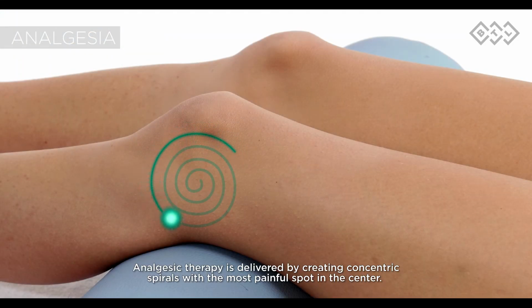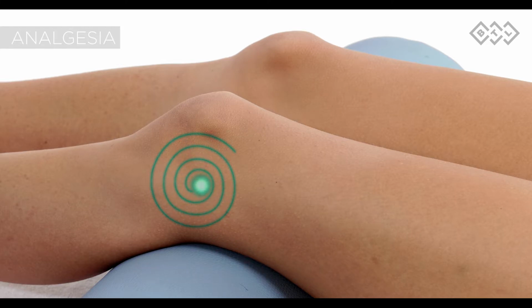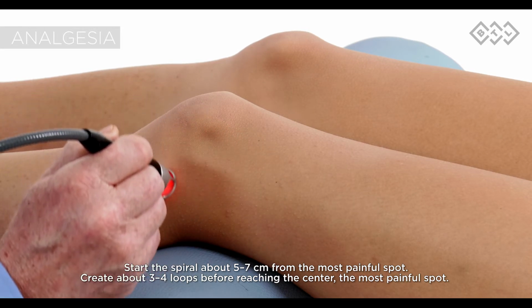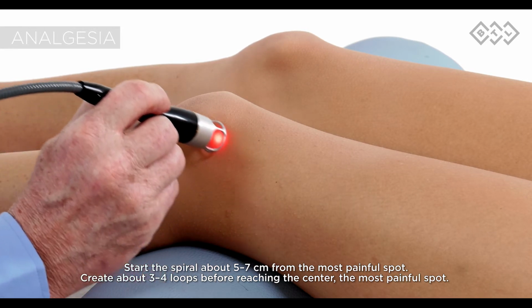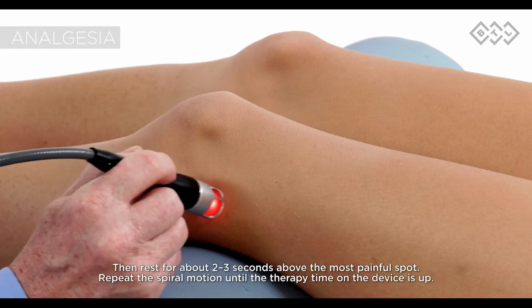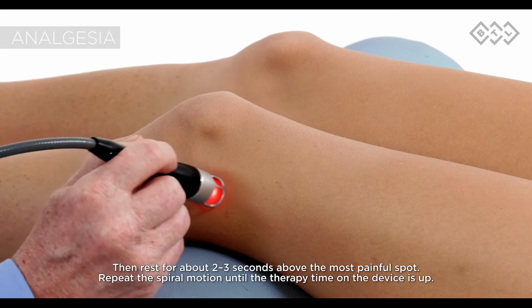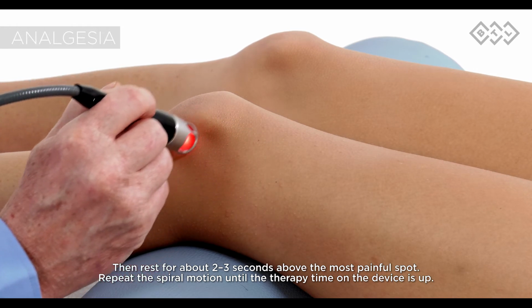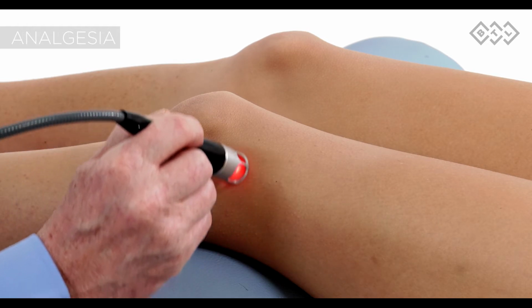Analgesic therapy is delivered by creating concentric spirals, with the most painful spot in the center. Start the spiral about 5 to 7 centimeters from the most painful spot. Create about 3 to 4 loops before reaching the center, the most painful spot. Then rest for about 2 to 3 seconds above the most painful spot. Repeat the spiral motion until the therapy time on the device is up.